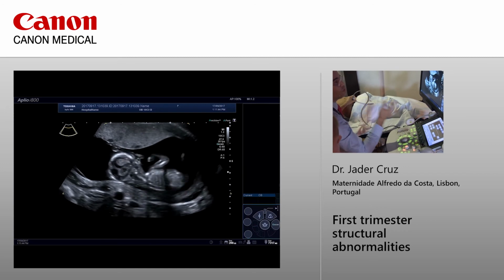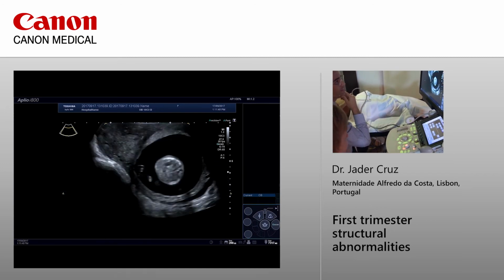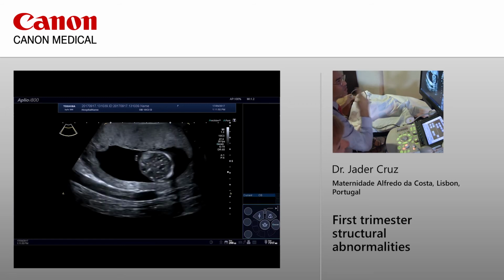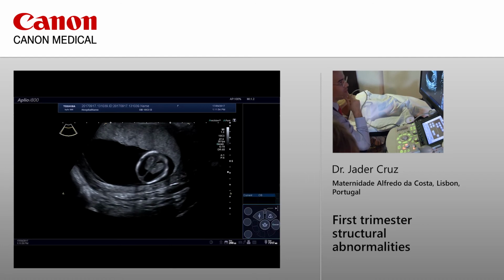I'm not going to say that Petra didn't load my presets. You have two sets of presets. You have my presets and then the presets that Petra calls mine.